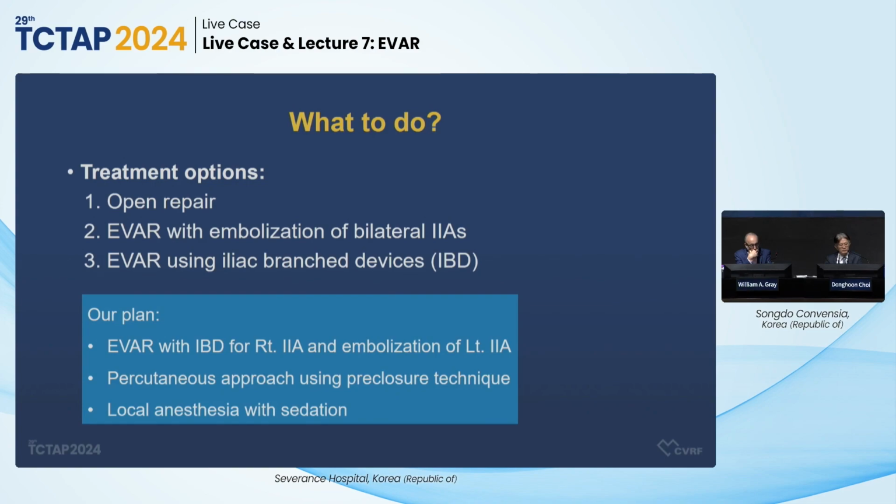Our plan was to treat this patient with a percutaneous approach, EVAR, using the pre-closure technique. We usually perform our EVARs under local anesthesia with sedation. Next slide.